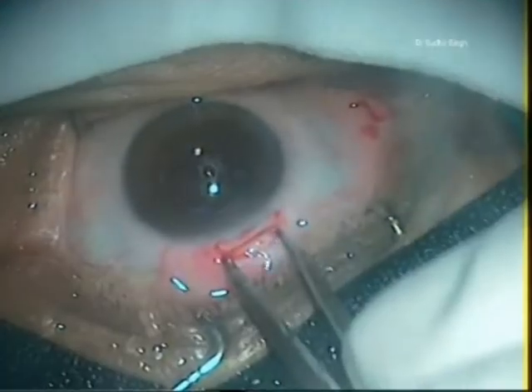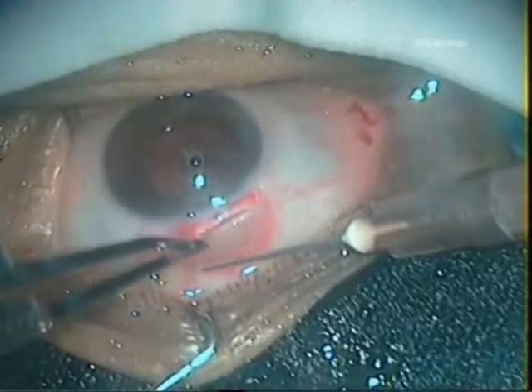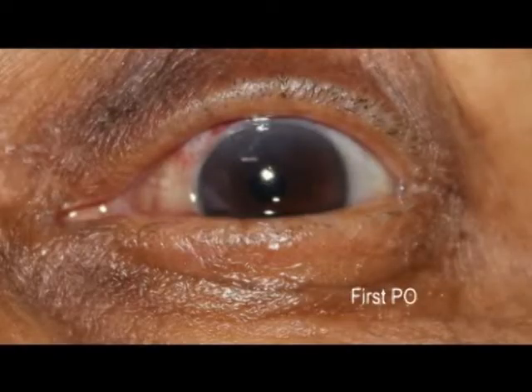Remaining visco is washed out. Port sealed by hydration. Conjunctival flap is reposited. First postoperative day, cornea was bright clear.